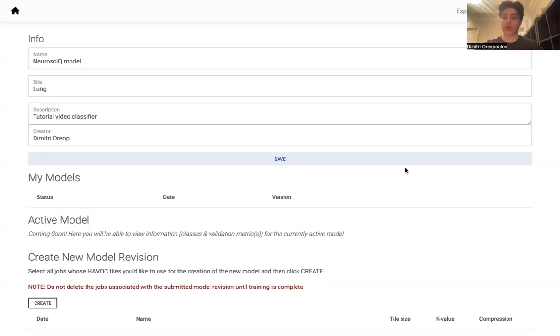For confirmation, you can also check your email, as you should have immediately received an automated email to the account associated with your PHARAOH account confirming your submission. The PHARAOH team will get started on training your brand new classifier immediately and will reach out if they have any questions before informing you when your classifier has been completed and is ready to be hosted on the platform.